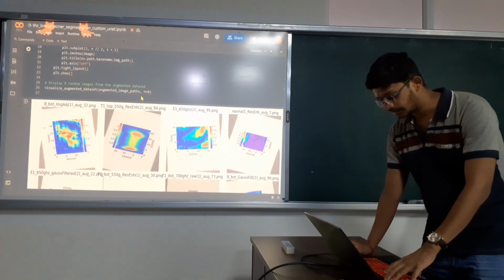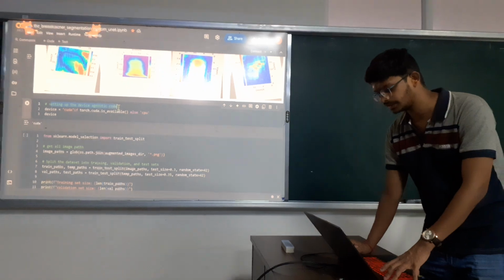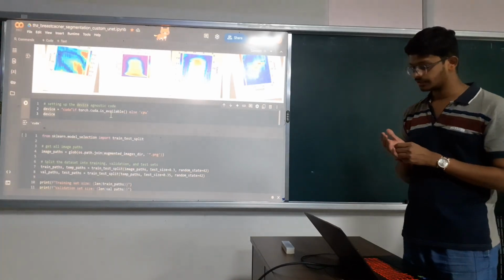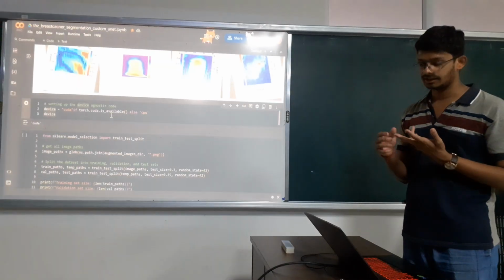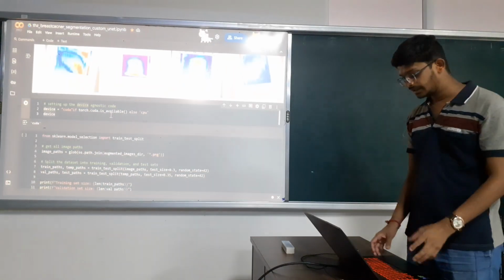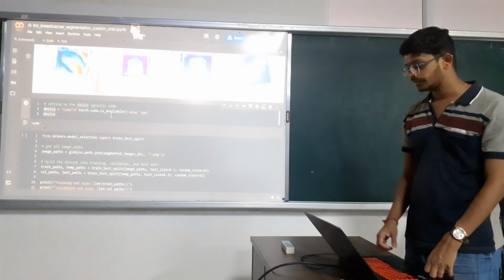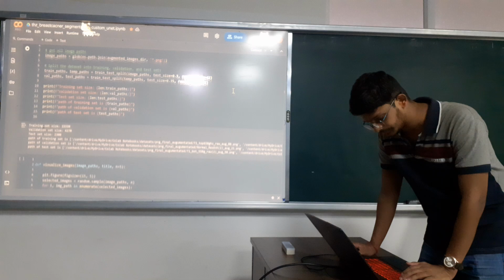Since we are done with the data engineering, now it is very important for us to set up the device agnostic code. This is very important since all the images here are converted to tensors, and those tensors will be having a lot of functionality of convolution, upsampling, downsampling, max pooling, bottleneck, then striding and padding for the U-Net architecture. So it will take a lot of time, and if I don't set up device agnostic code and use CUDA, the problem that will appear is that I cannot use the GPU functionality here for processing the task.